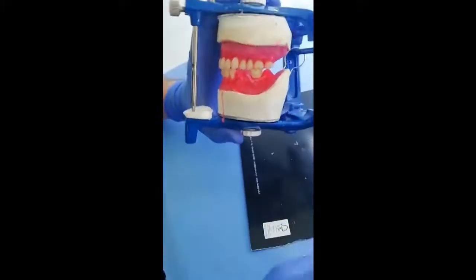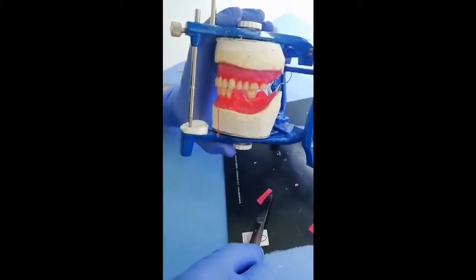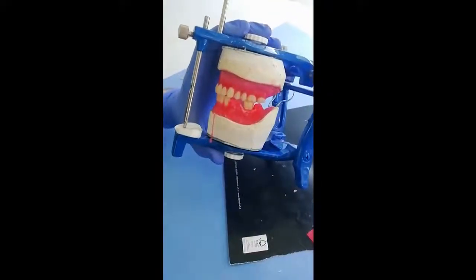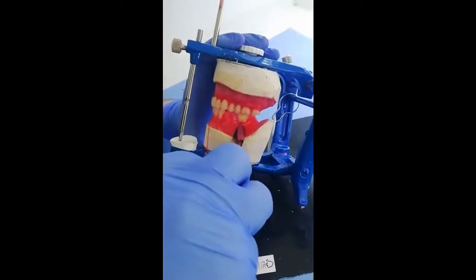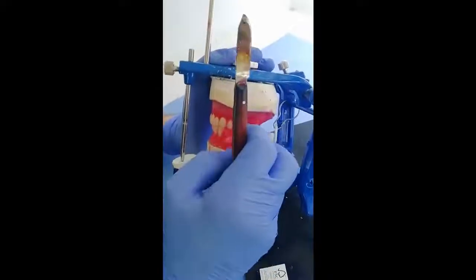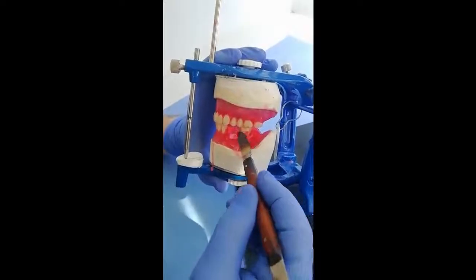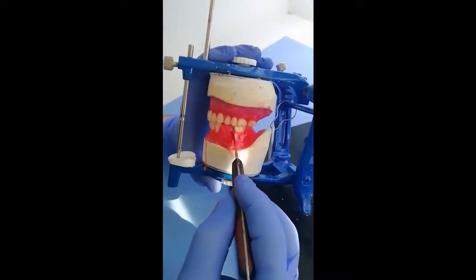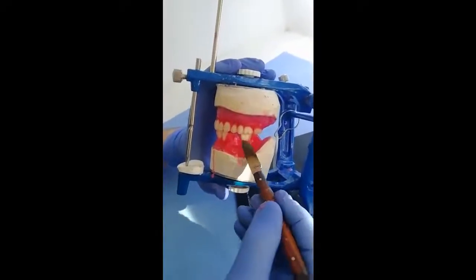Now we take a piece of wax and fix the first molar in its proper position in the lower wax rim. You can notice here that the amount of wax around the first molar is enough to accommodate the first molar.